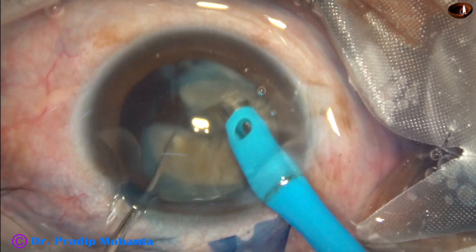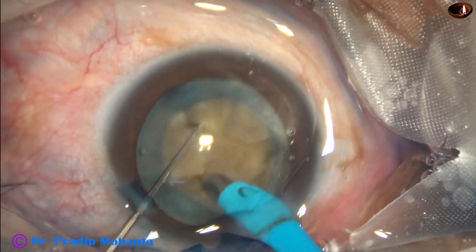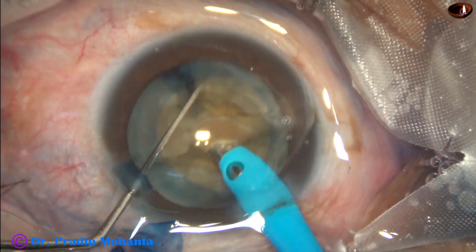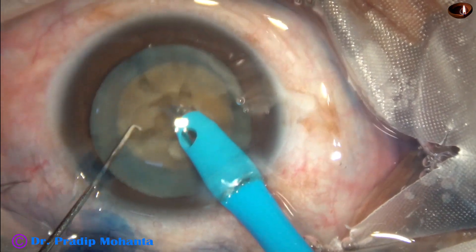Then one more crack. And we find this endonucleus — the hardest part of this cataract. This endonucleus is emulsified.